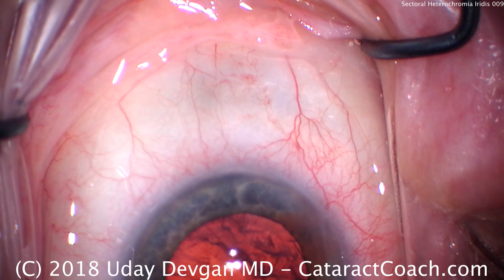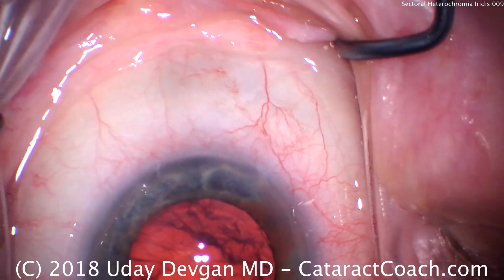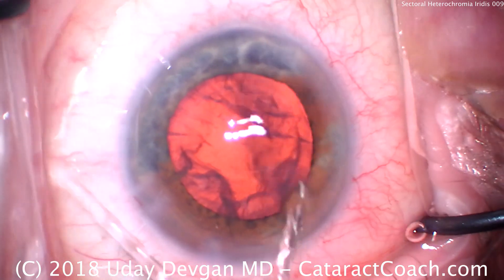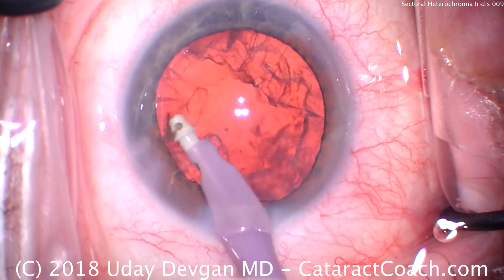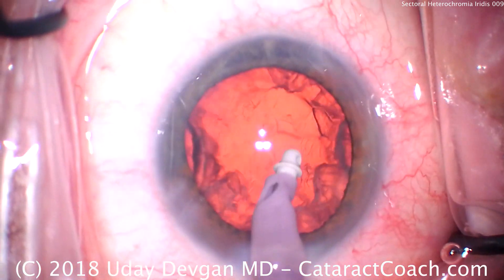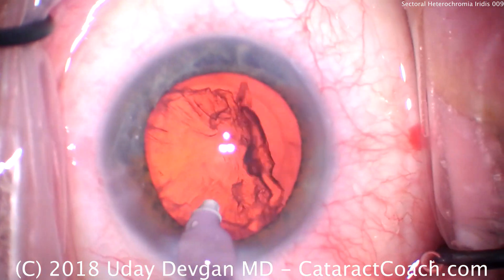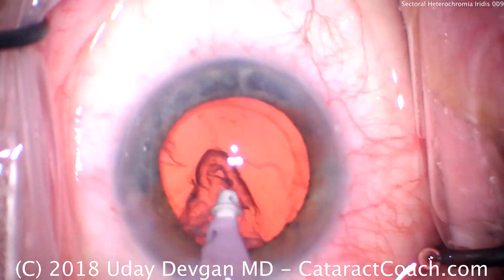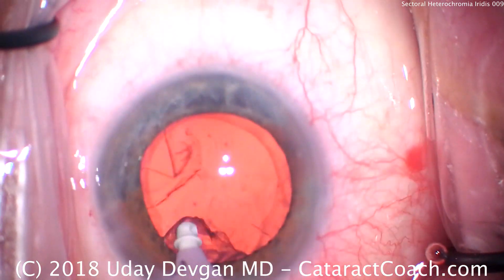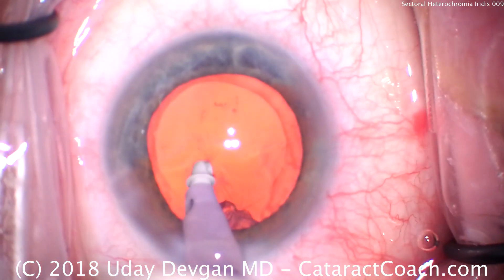We'll switch to the IA probe. This is also the time where I have the technician start loading the lens. For the IA probe, here we're using a coaxial one — a lot of people do bimanual, and that works great too. A small chunk of nucleus we take out. Here's the remaining cortex, and I like to move in a circumferential manner to remove the lens cortex. This way it comes off in large sheets. I'm also looking at the capsulorhexis edge to make sure that doesn't move — moving would be a sign of bad zonules.